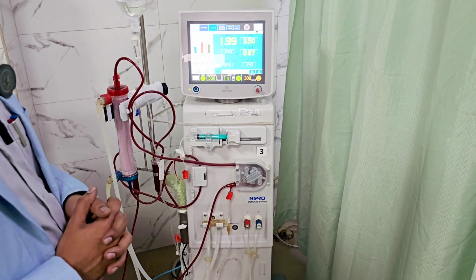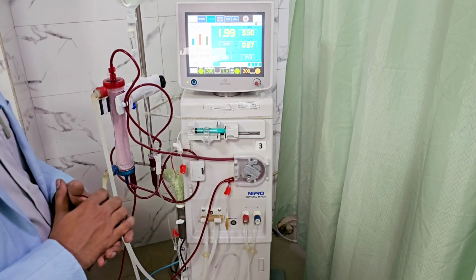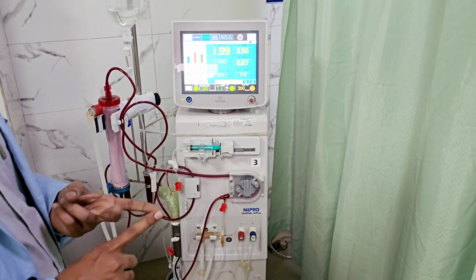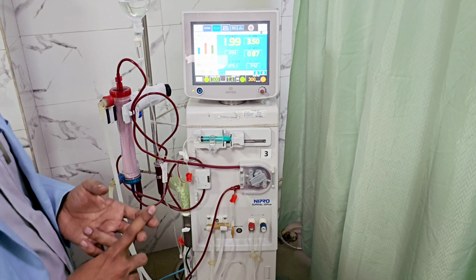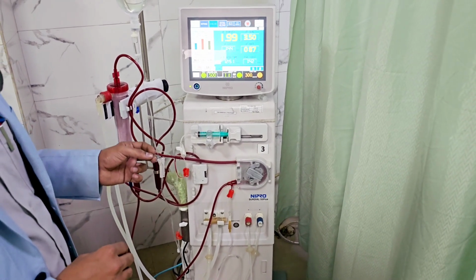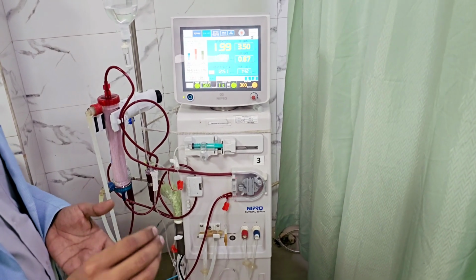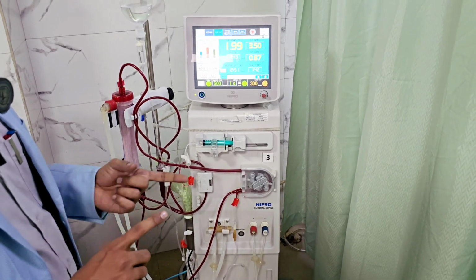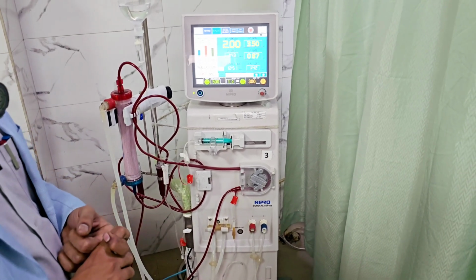Is there any other way of giving anticoagulation? Despite this, there are some situations where clotting can occur. What to do? First step is high frequency of flushing with normal saline. Another entity called regional anticoagulation is used. That is, once the blood comes out of the patient, it will be mixed with the anticoagulant, and while going back, it will be neutralized. That is called citrate anticoagulation. It is used in most centers in CRRT, not in hemodialysis. So this is all regarding heparin-free dialysis.